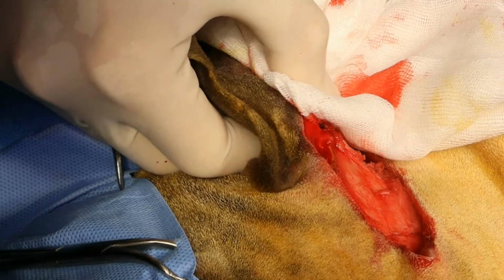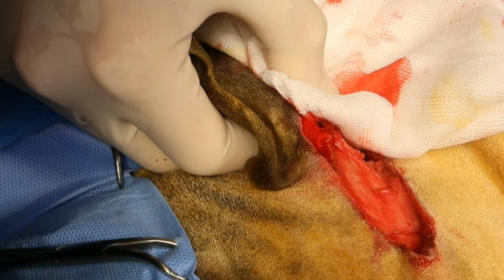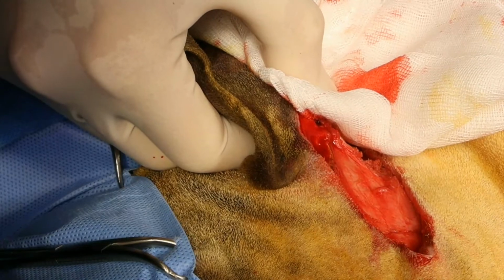Yeah, so using the electric cautery definitely accelerates my surgery time, 100% without a doubt.